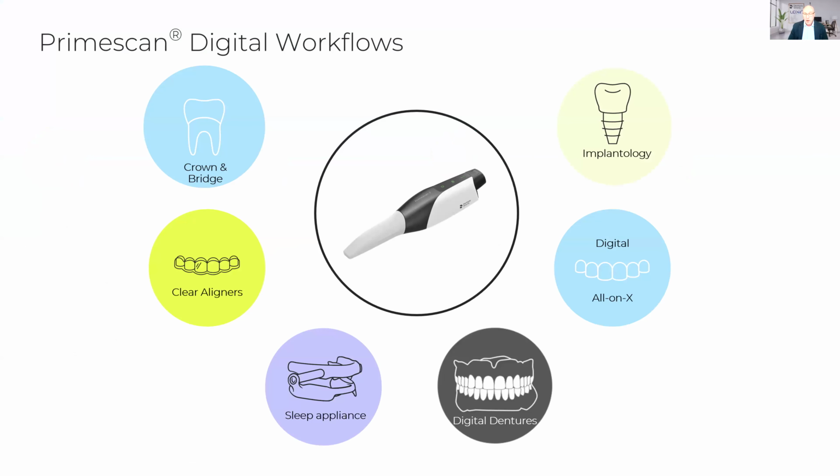So let's jump into PrimeScan specifically on the digital workflows. PrimeScan is able to do crown and bridge, clear aligners, sleep appliances, digital dentures or dentureless workflows, digital all-on-X, we're able to do as well as implantology.